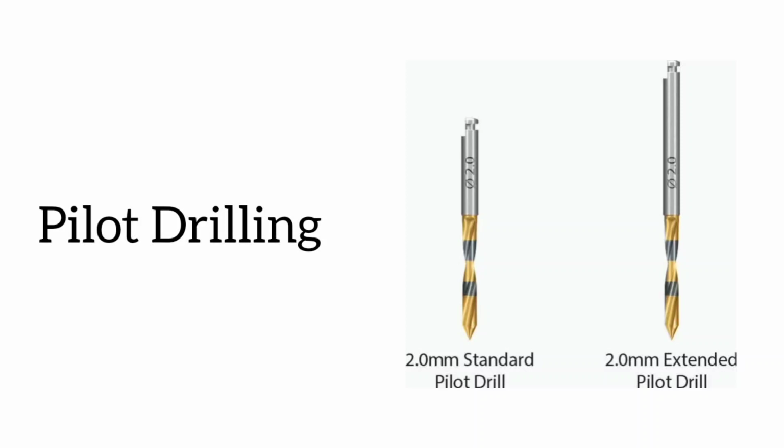Drilling should only be performed under a constant stream of chilled saline, so heating of the bone is prevented, which can cause bone necrosis. In tight spots where vital structures are adjacent, like a mandibular canal or a maxillary sinus, a periapical X-ray is taken with the drill in position to double check the direction of the osteotomy. Osteotomy means cutting, modifying or moving of the bone. If the surgeon has wavered from the right direction, he can correct the angulation at this point.